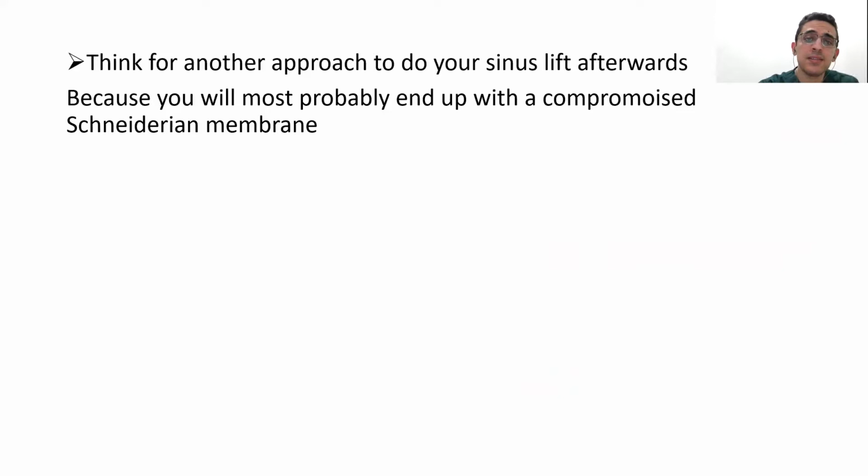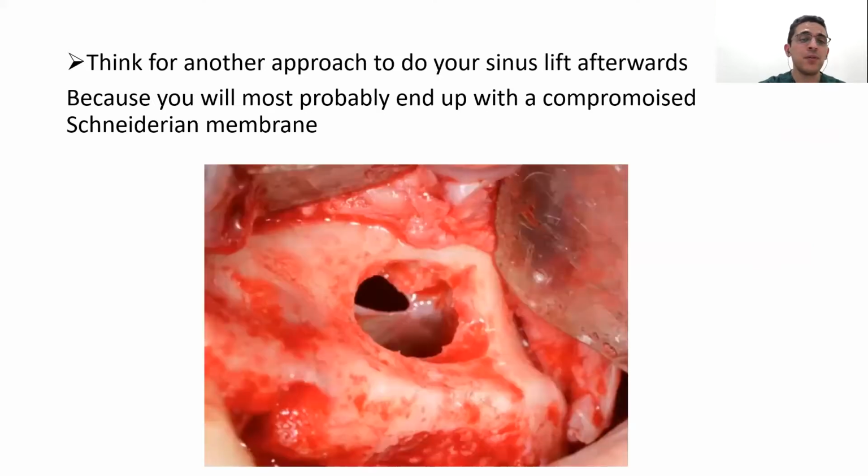Another thing is, as we have said before, the ultimate goal is to reconstruct this area. We are not just trying to find a solution, but we strive to reconstruct this area afterward with another implant and make another sinus lift. So if you have a compromised sinus lift, because you will tear the Schneiderian membrane. Let's be realistic, in order to enter and retrieve the implant, you will tear the Schneiderian membrane.